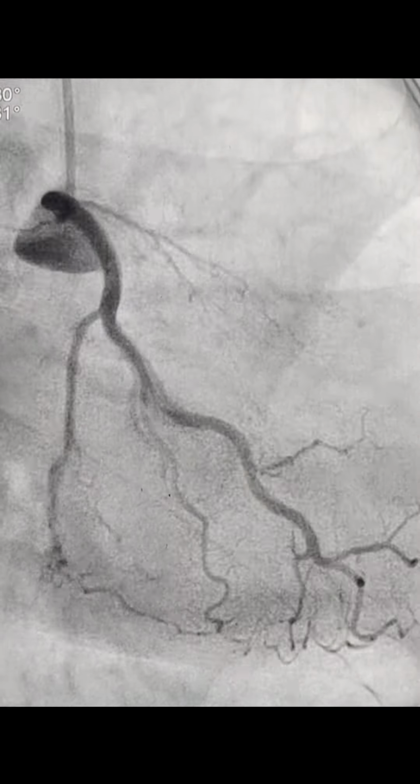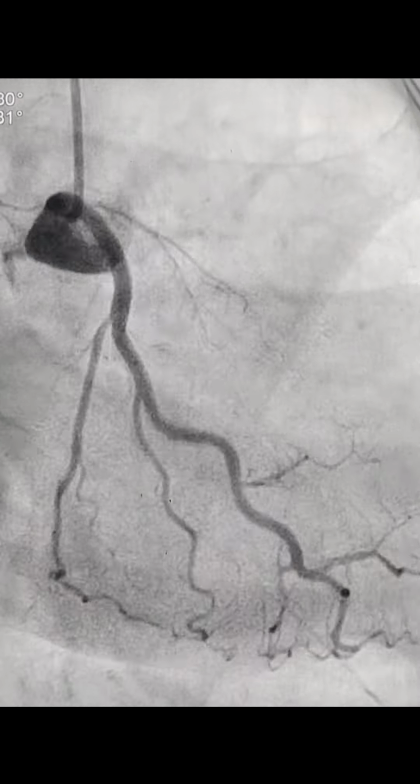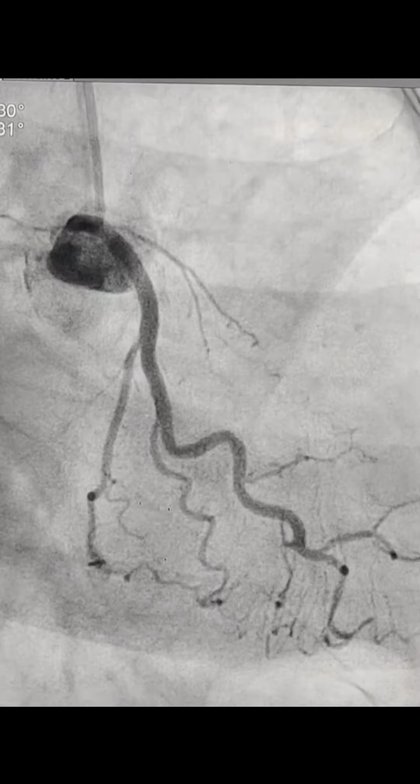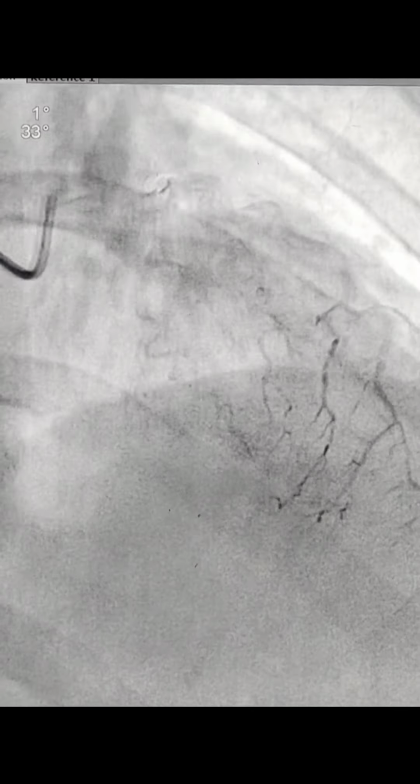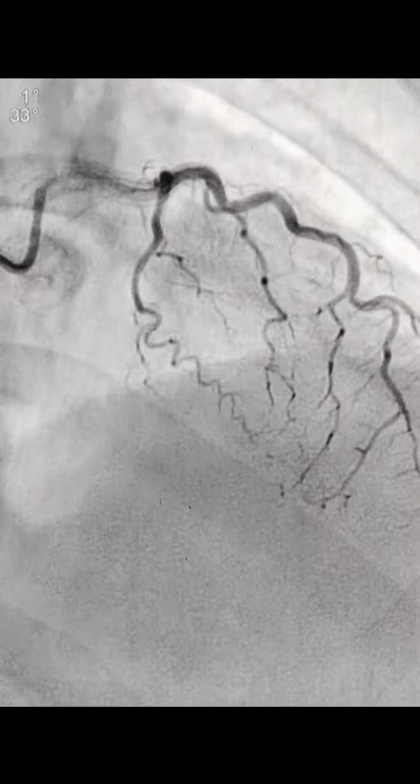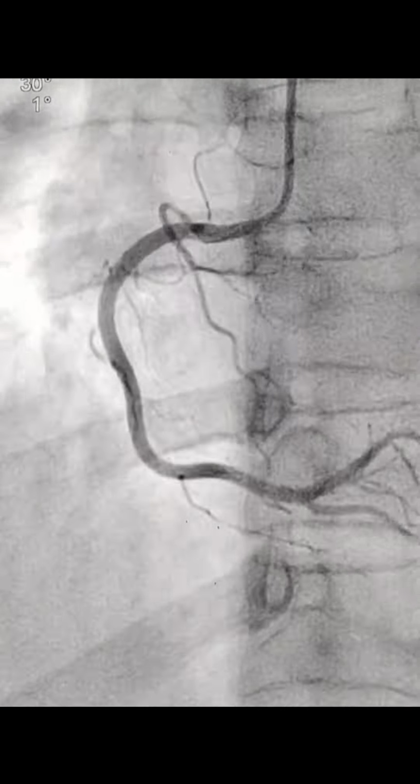This is a caudal view, and you cannot see the LAD because it was closed from the ostium, and it has a separate origin. There is no LM. There is the cranial view, and there is no LAD seen. This is LCX. This is RCA, dominant, normal.